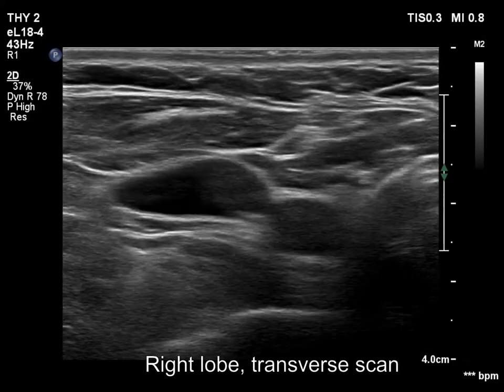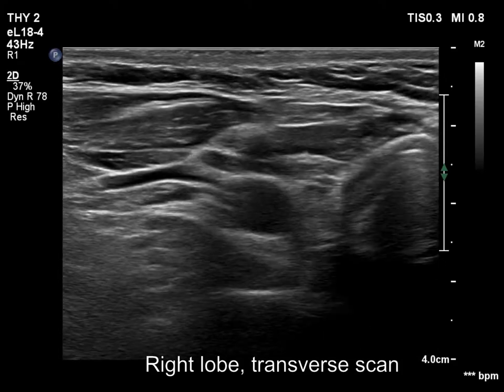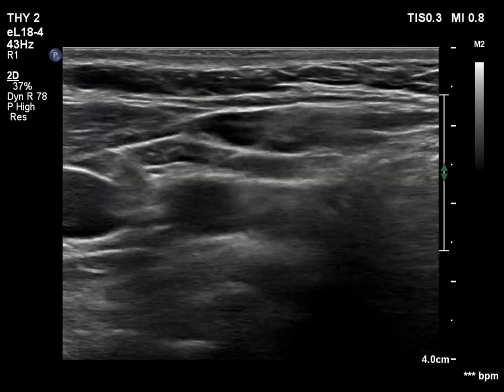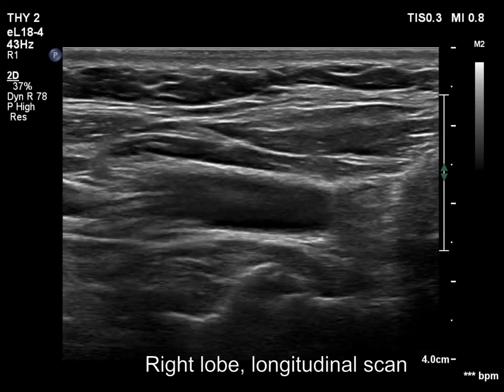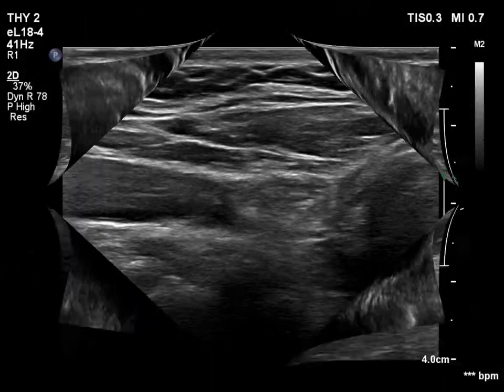The right lobe was removed and is replaced by connective tissue. There is no normal thyroid tissue in the right thyroid bed.